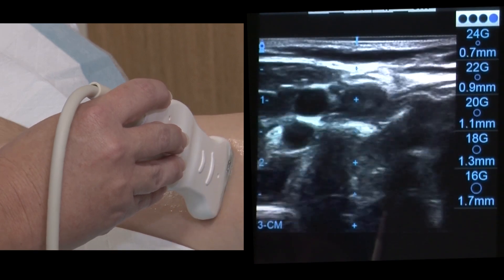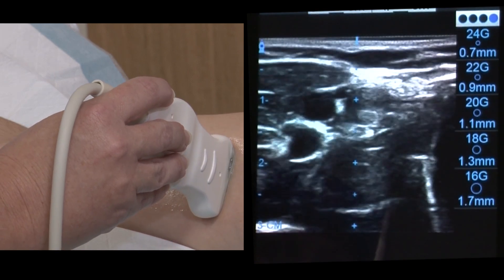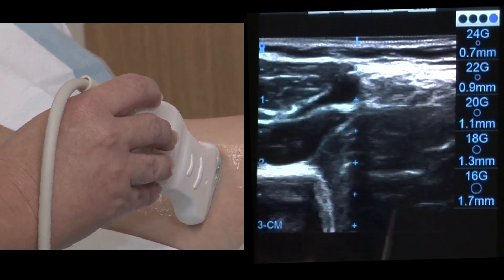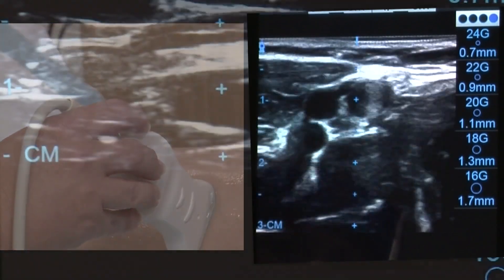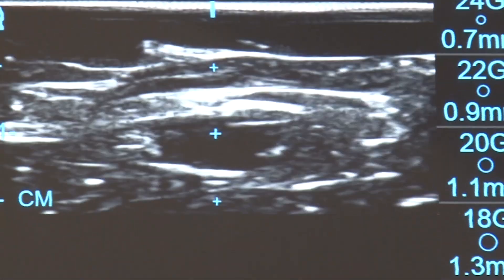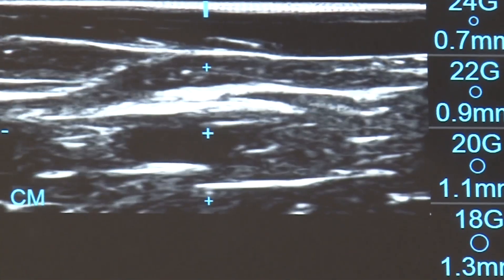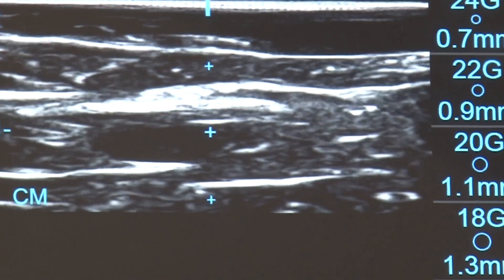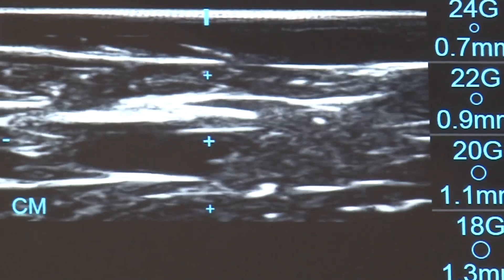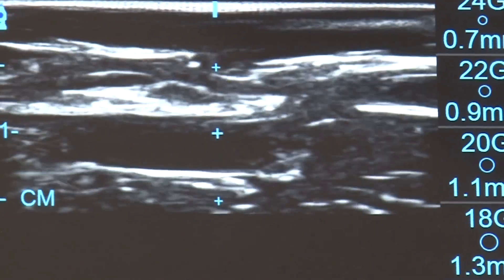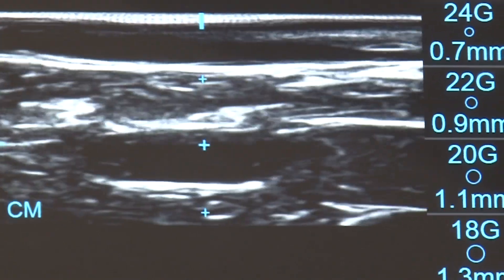Both in and out of plane approaches are viable options for ultrasound technique. However, it should be noted that in-plane technique does not allow for visualisation of surrounding structures such as nerves and arteries.